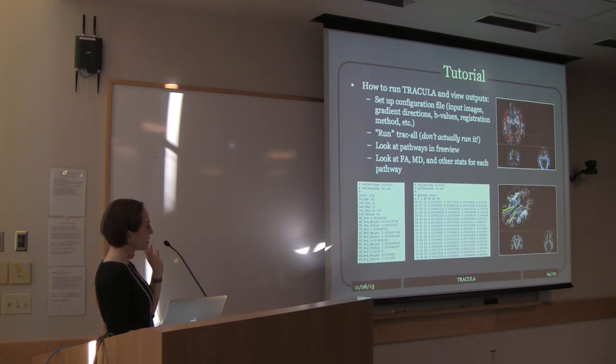You're going to look at the pathways in FreeView. You're going to see how you can look at each pathway, the voxel-wise probability distribution of that pathway, and also how you can visualize all of them together with the minus TV or track volume option in FreeView.